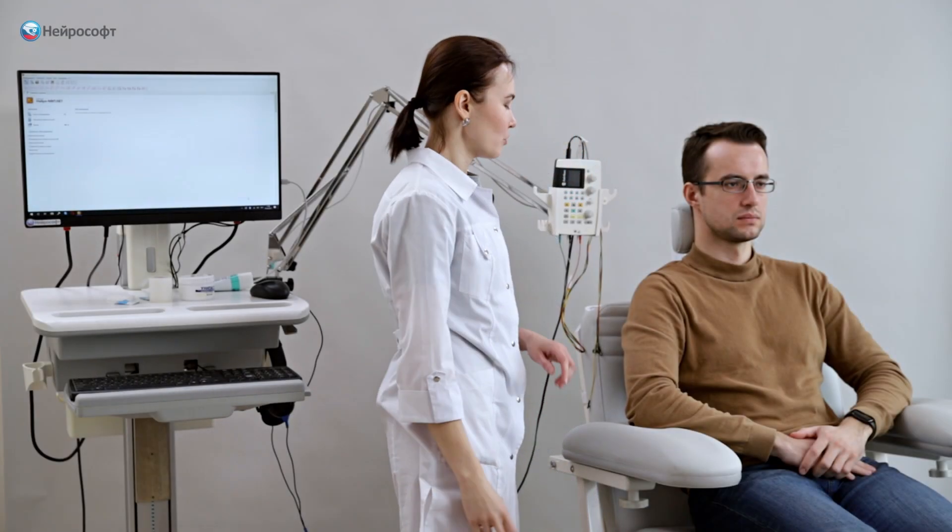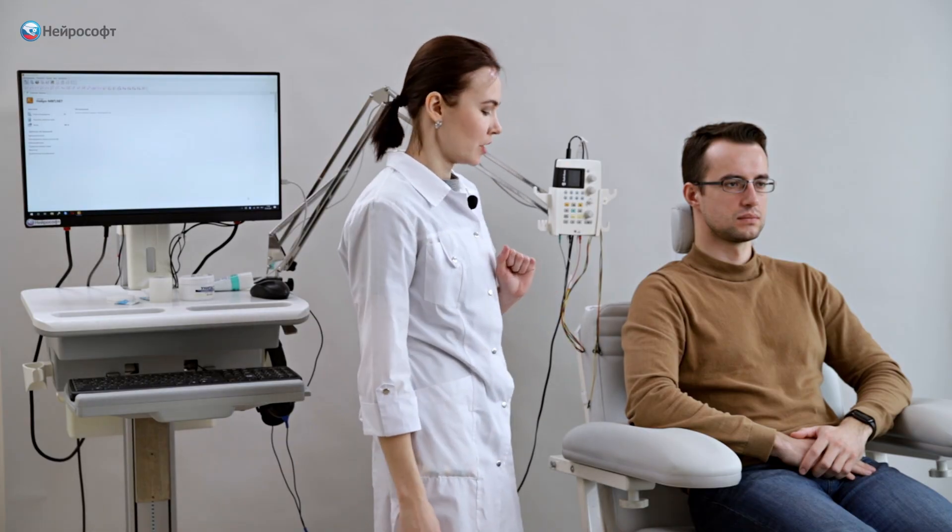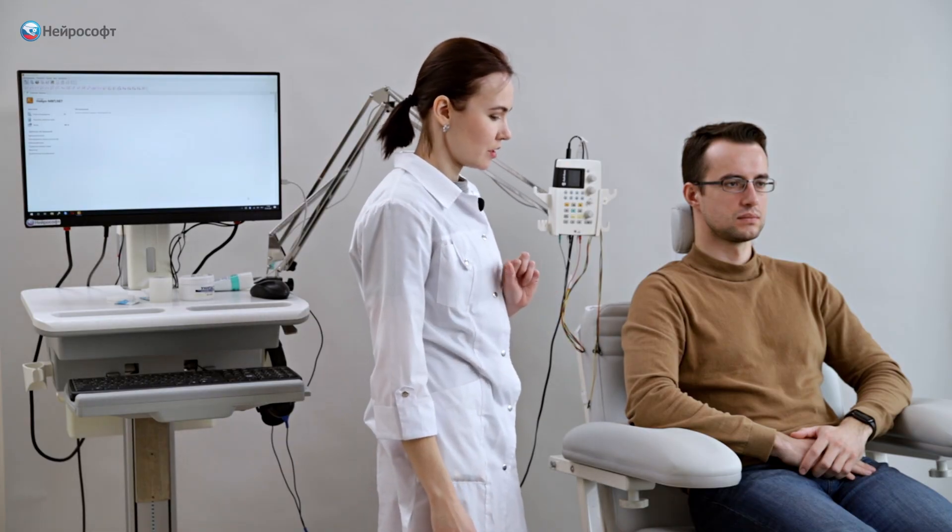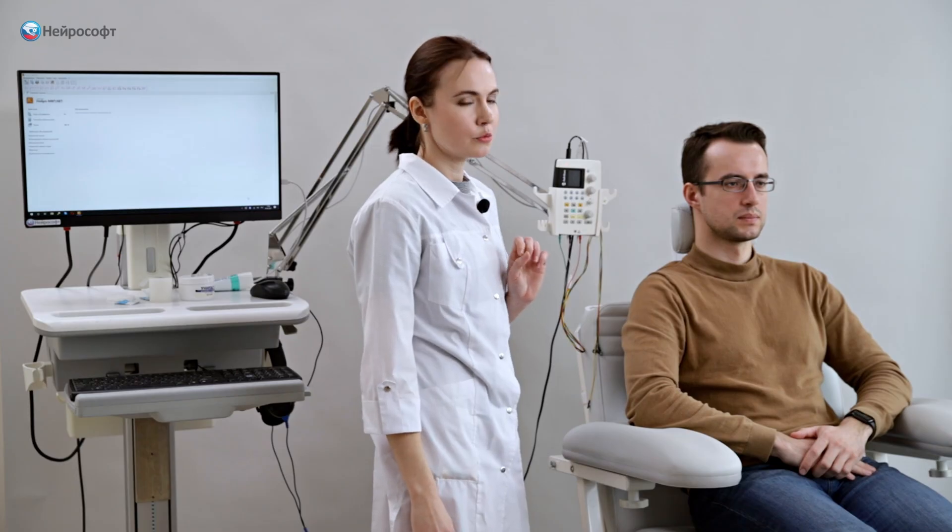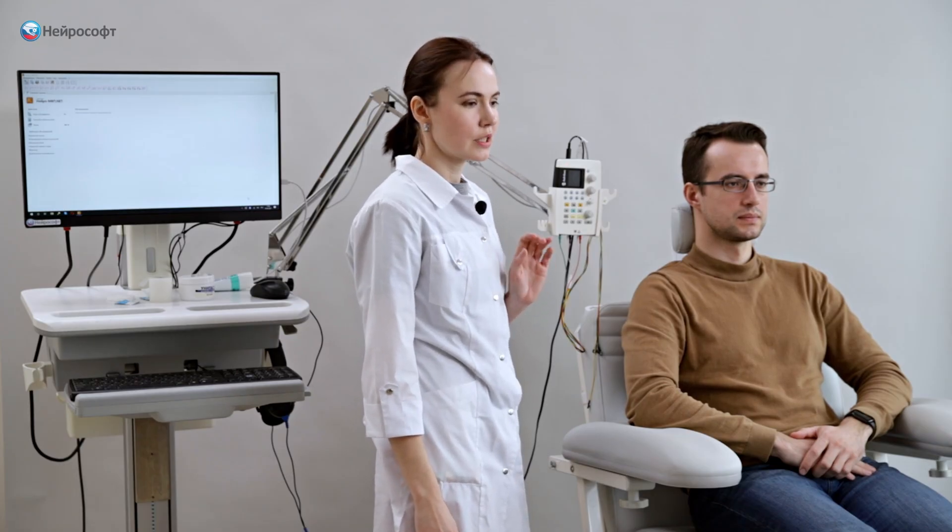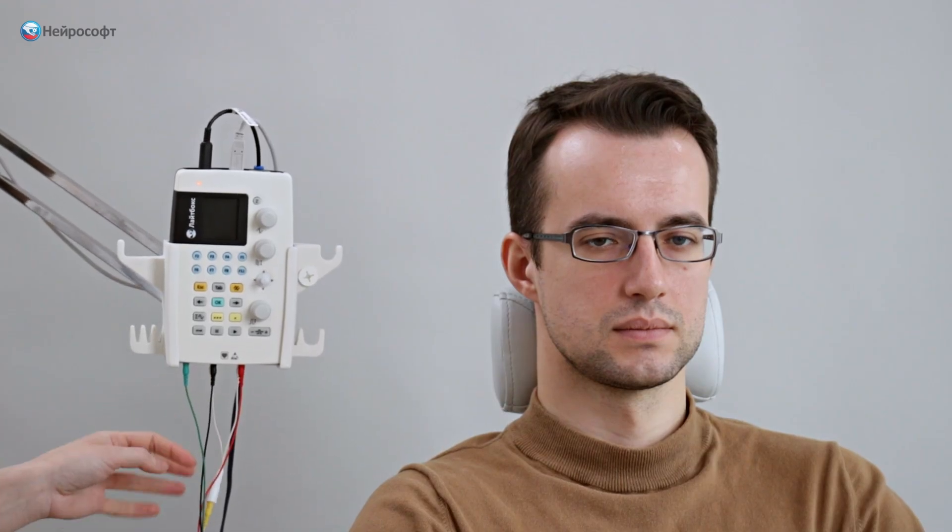Now we can start positioning the electrodes. We use a two-channel recording scheme with recording of the response on the ipsy side and contralateral recording side. The active electrodes will be placed on the mastoids, so we can start positioning them.